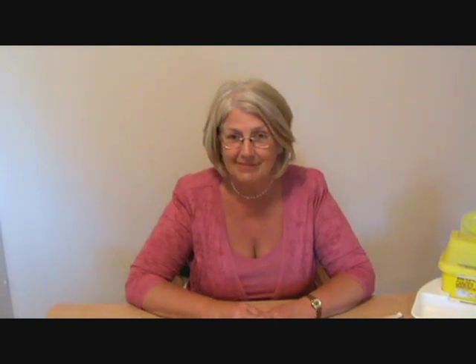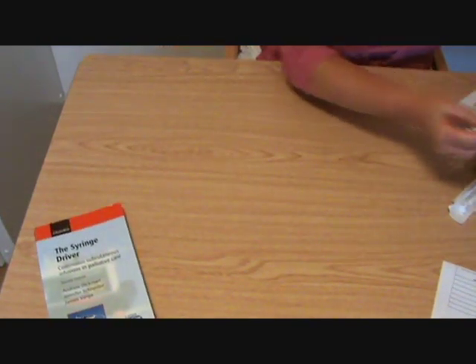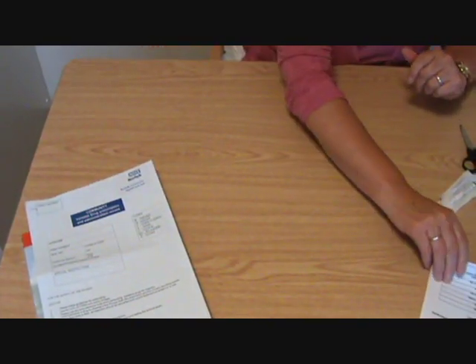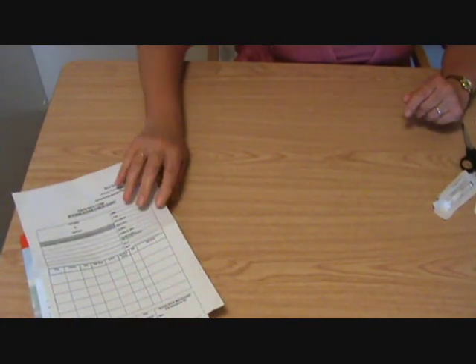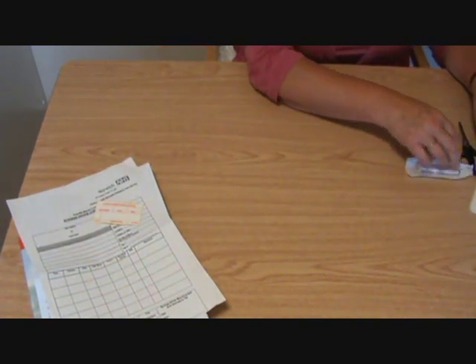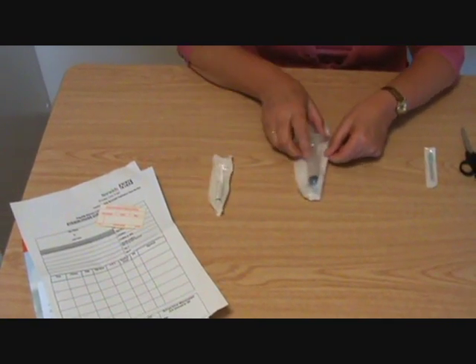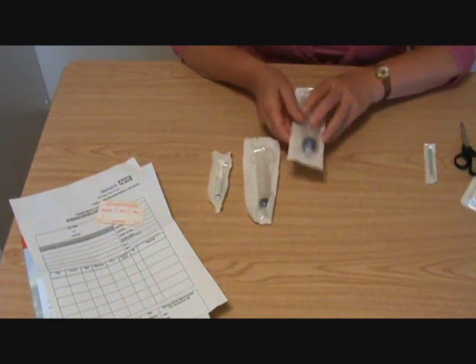I'll show you all the component parts one by one and then we can put them together. First of all, you might like to have the Andrew Dickman book about the syringe driver with you. You'll need to have the valid prescription for your drug. You need to be able to check what is in your driver, so you'll need a syringe driver checklist. You will need to have a label and a variety of syringes — some to draw up and others to actually use in the syringe driver. We use a 20ml syringe or a 30ml syringe.